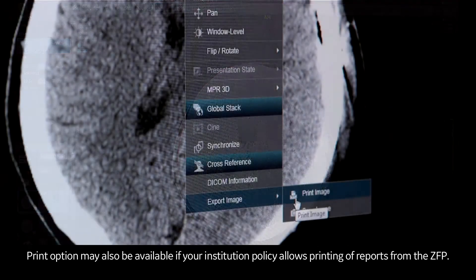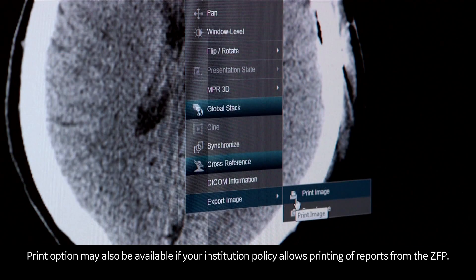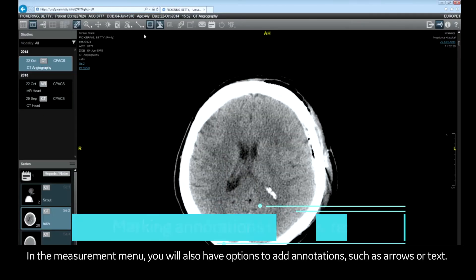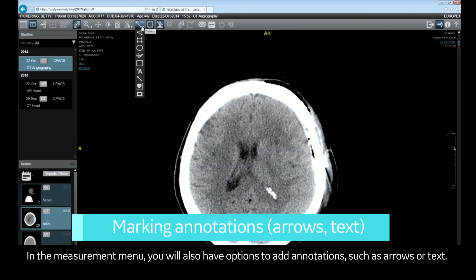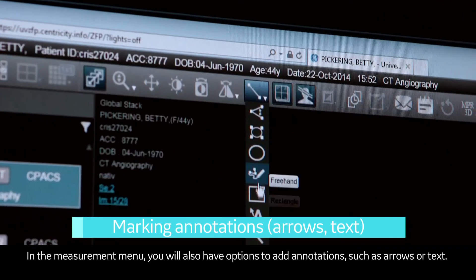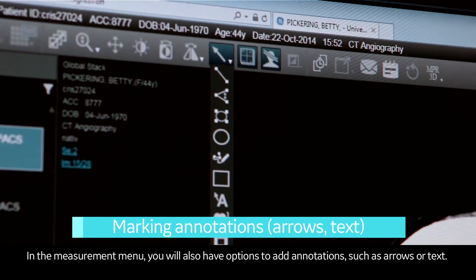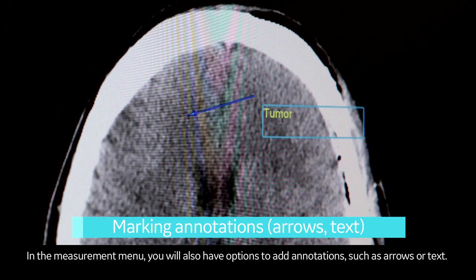The print option may also be available if your institution policy allows printing of reports from ZFP. In the measurement menu, you will also have options to add annotations such as arrows or text.